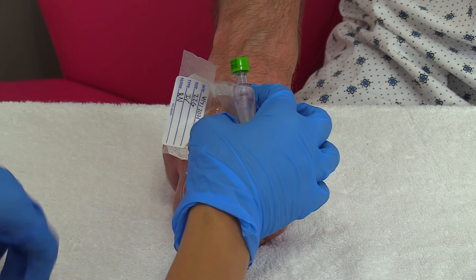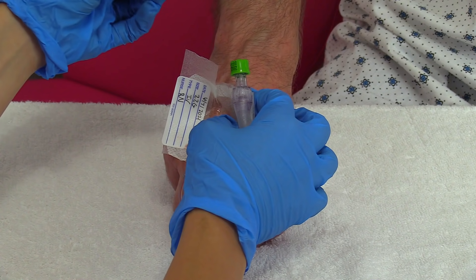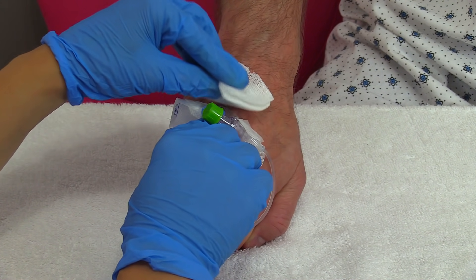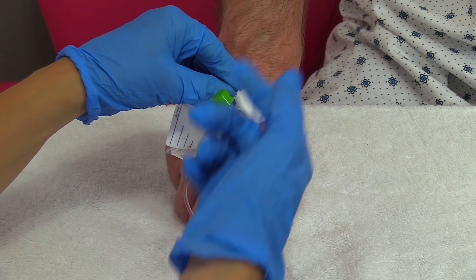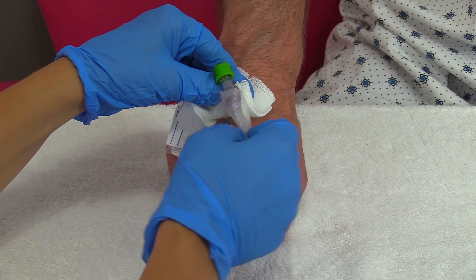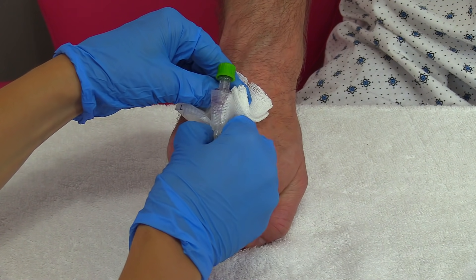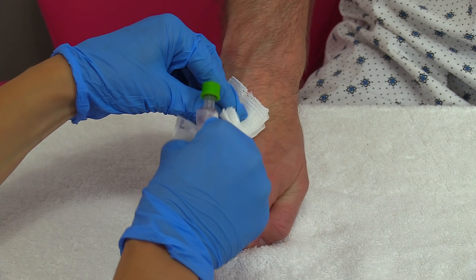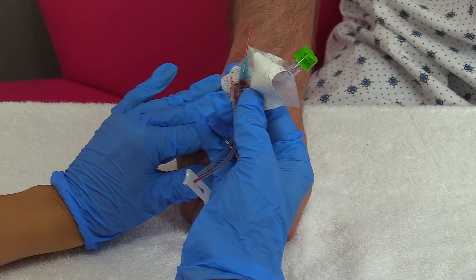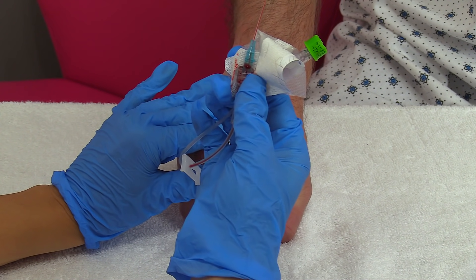Once you have all the surrounding tape off, you're going to take your gauze and place it over the site because you're going to be sliding this cannula out. Take everything, grab and pull the cannula in one smooth motion, hold pressure, and inspect your cannula to make sure everything is intact.